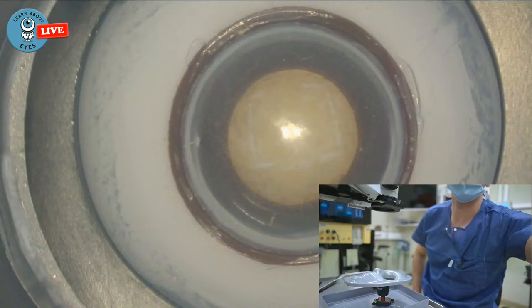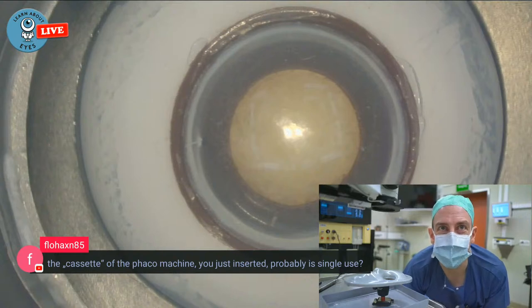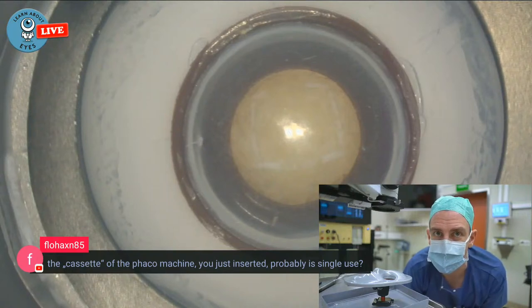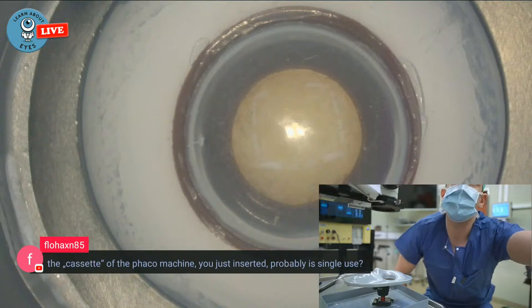Sorry, I missed a couple of questions from Flo about that. So the last one was, is the cassette of the phaco machine you just inserted probably a single use? Yes, it is. Or at least here it is. So in India we were reusing these again and again, but it definitely is single use here. Let's take this one out.